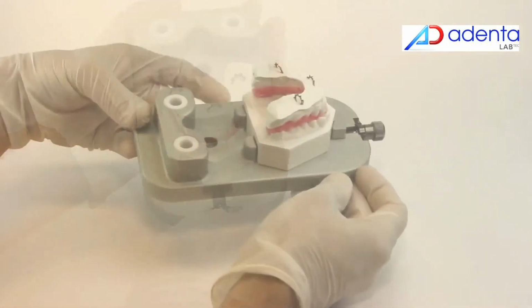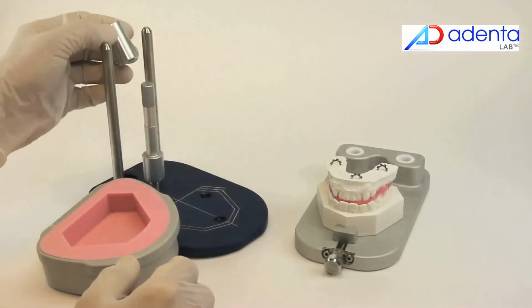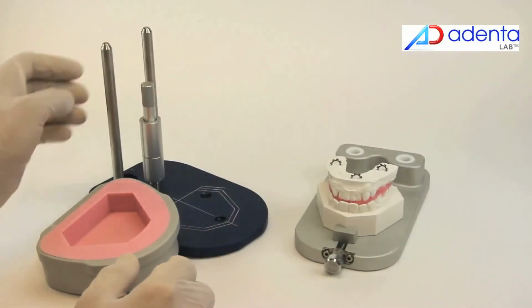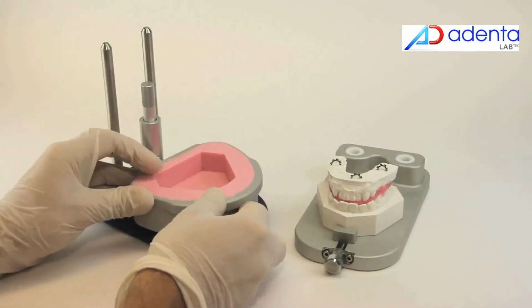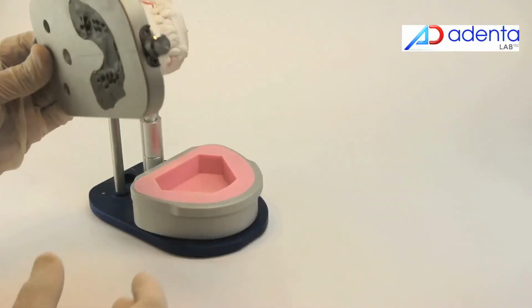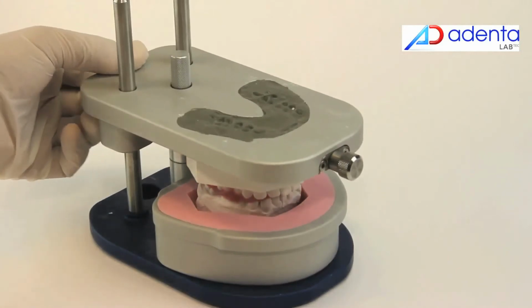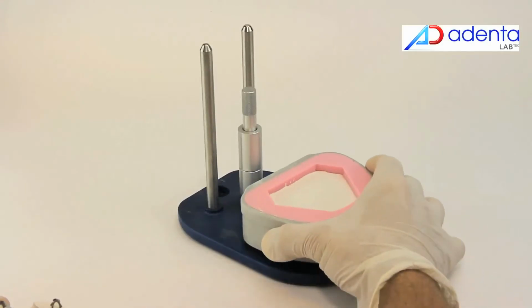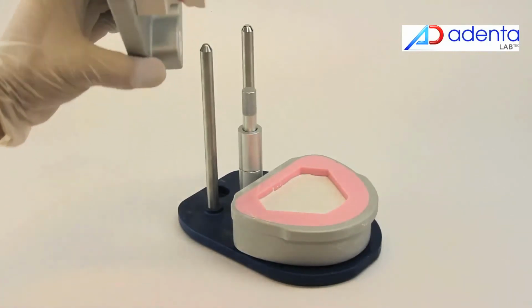For modeling inclusion, the B side of the positioning plate is used to fit the upper model with the screw. It is placed on the system base. Using the distance tube to establish the lower model height, it is fixed with a screw.